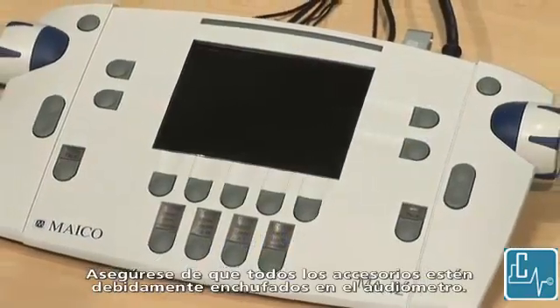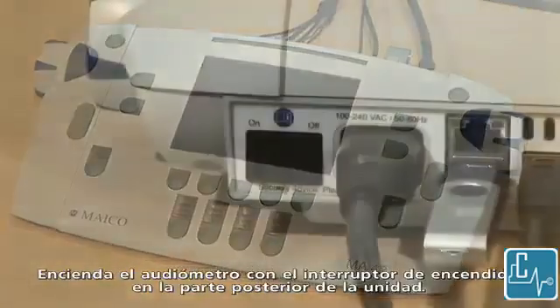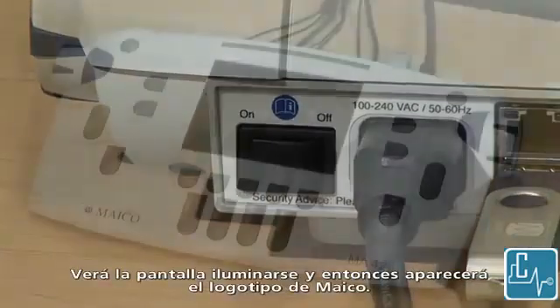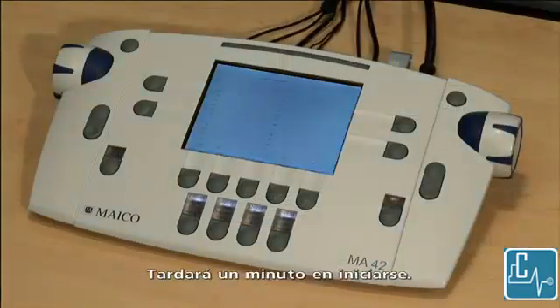Make sure all of the accessories are properly plugged into the audiometer. To turn on the audiometer, flip the power switch on the back of the unit. You will see the screen display light up and then the Maico logo appear. It will take a minute to boot up.